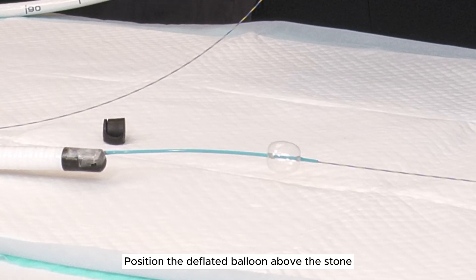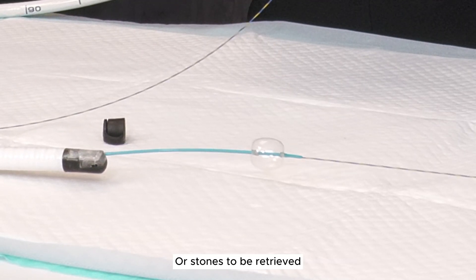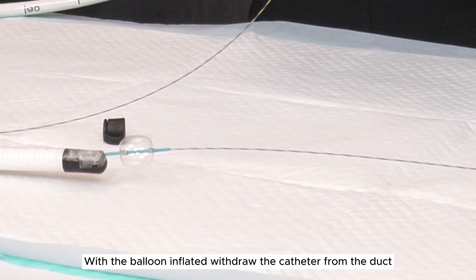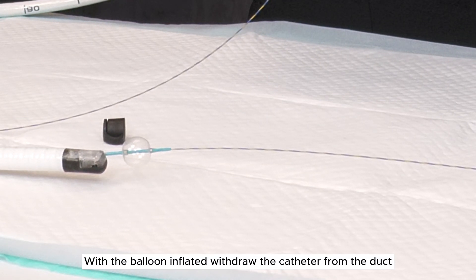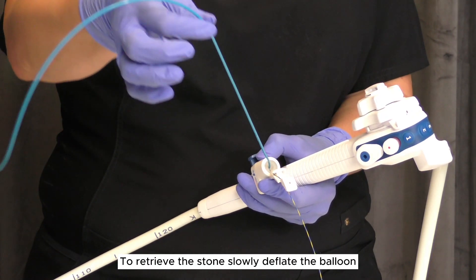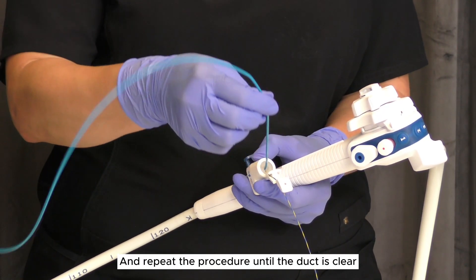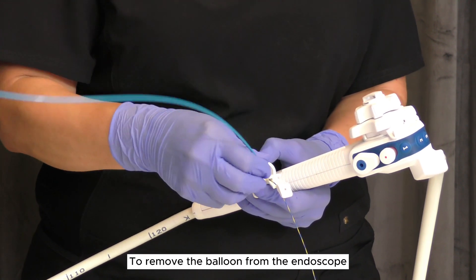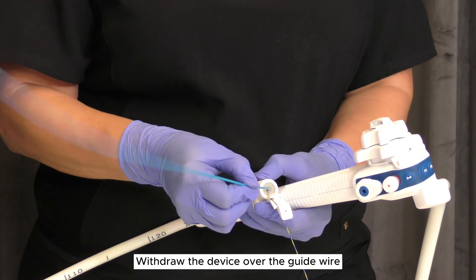Position the deflated balloon above the stone or stones to be retrieved. Inflate the balloon with air, then lock the stopcock. With the balloon inflated, withdraw the catheter from the duct to retrieve the stone. Slowly deflate the balloon and repeat the procedure until the duct is clear.